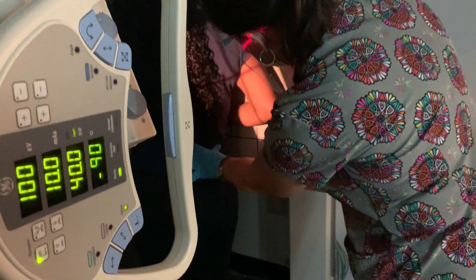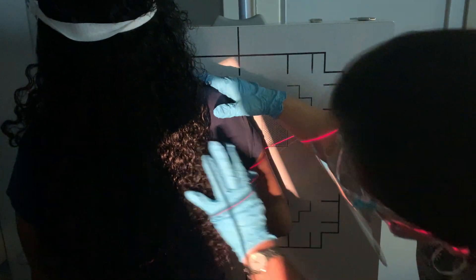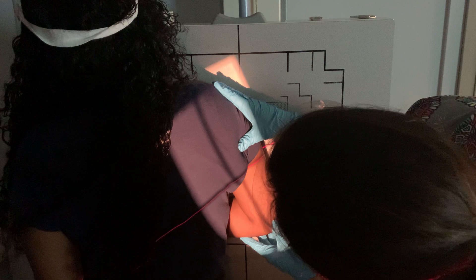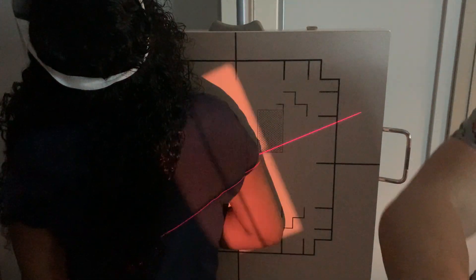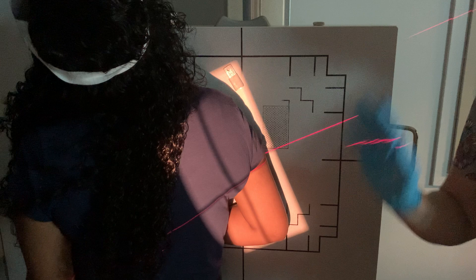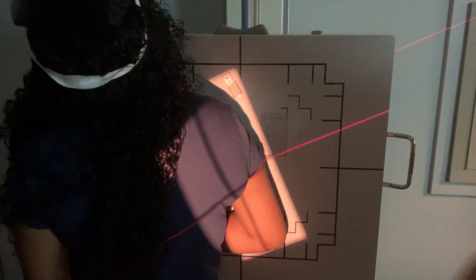Step you over. Keep her humerus on that center chamber. Relax her shoulder just a little bit. I've got to have a 90-degree angle at the elbow to keep those epicondyles perpendicular to one another. Put a right — no, left mark. No, we're right arm now. This is going to be right arm because we switched and we're doing PA. Coming through, collimation. Got light on both sides of the humerus coming in. Got her shoulder joint and her elbow joint.